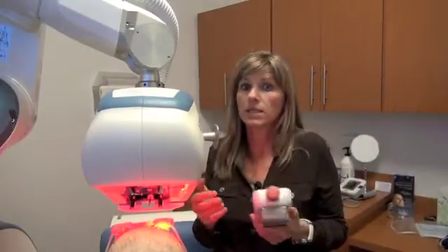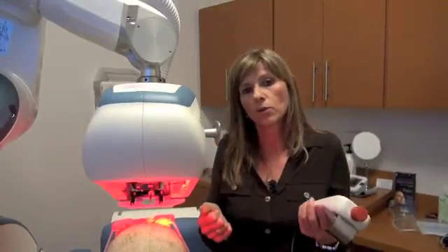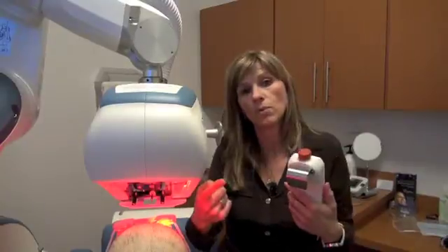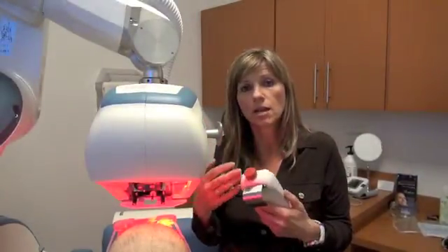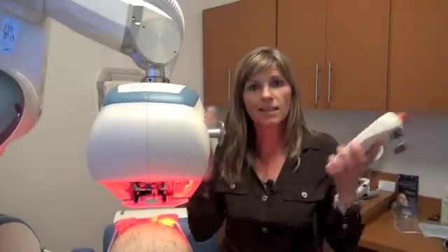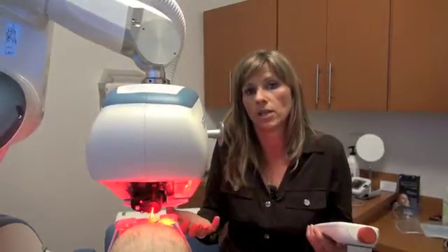But most importantly, it's very easy to resume. If you think about it, if you power off your computer fast, it will take time to reboot. This system is built so that immediately the physician can resume. I unclick the button, press the little button, and there it goes — we are ready to continue. So the procedure continues very easily.